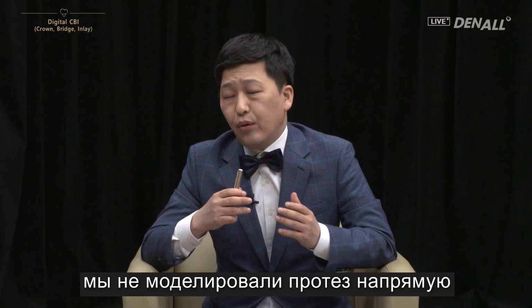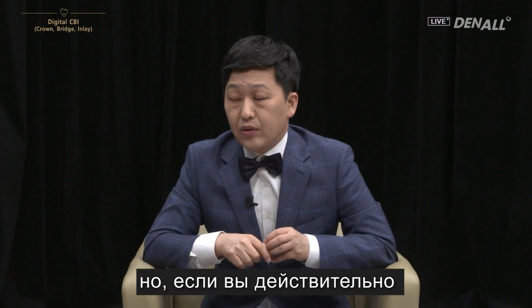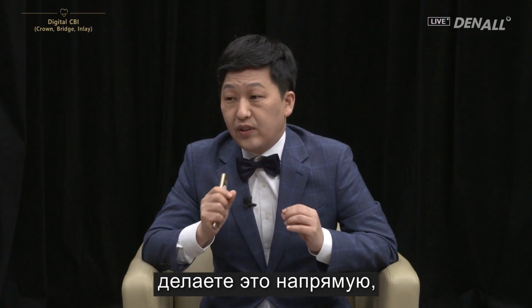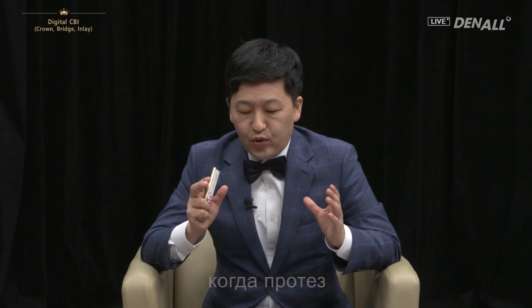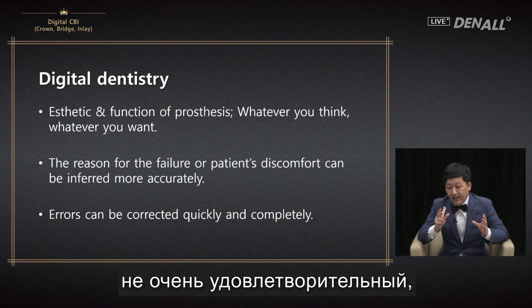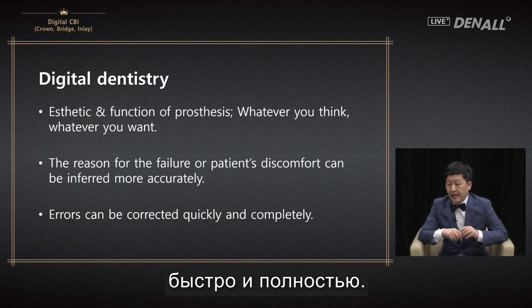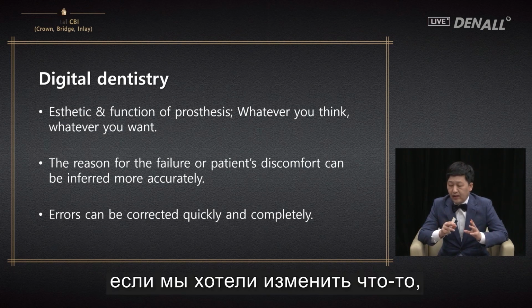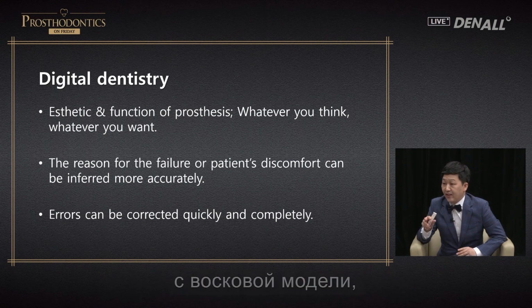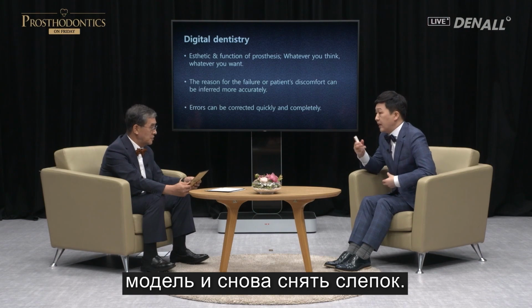In the analog days, we do not directly design the prosthesis and do wax up, so we cannot do it accurately. But if you actually do it directly, you can understand them more deeply. Finally, when the prosthesis is not really satisfactory, errors can be corrected quickly and completely. In the analog days, if we wanted to change, we needed to start from scratch, from wax up. At times, you need to remake the model and take impression again.